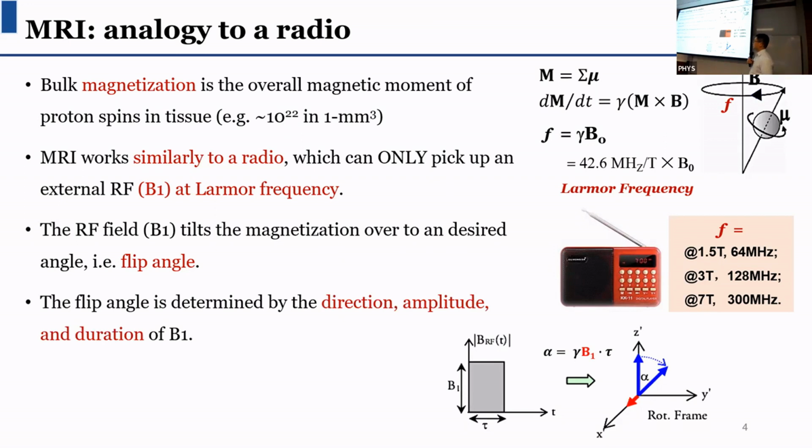As I mentioned, this flip angle is determined by the direction of this B1 field, its amplitude, and its duration.